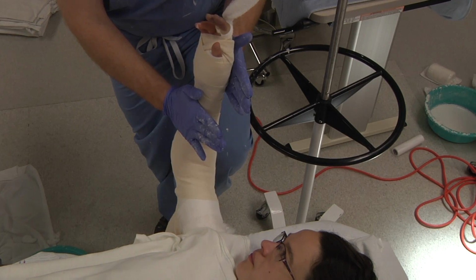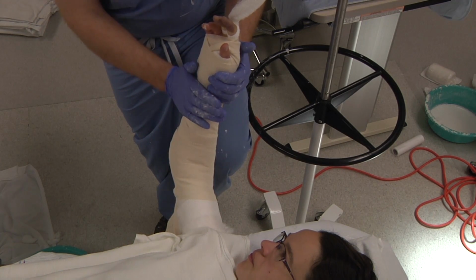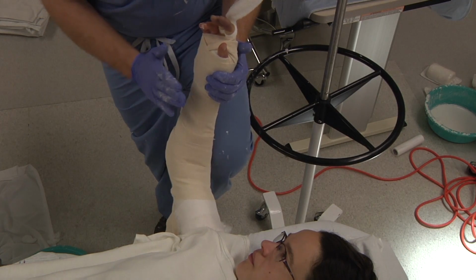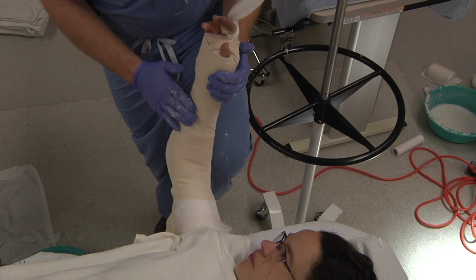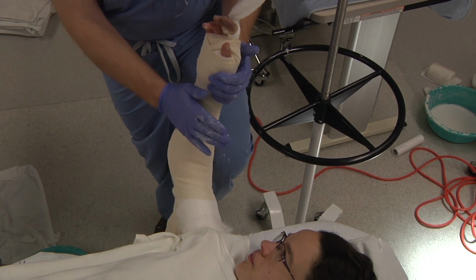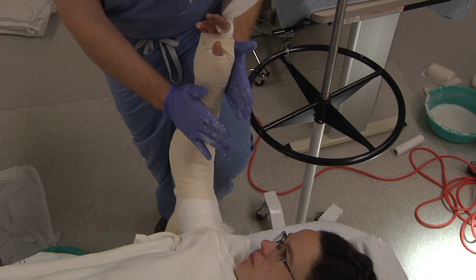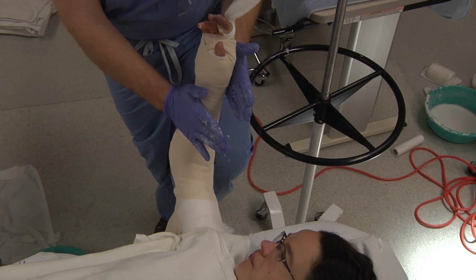And from there, it's very, very important to hold the splint material until it's hard, especially in distal radiuses, and with this long arm splint or short arm splint, it's easy for you to lose your reduction if you don't hold it until the plaster material is actually hard. And this can take, with non-catalytic plaster material, a good 10 minutes, but it's worth maintaining that reduction.